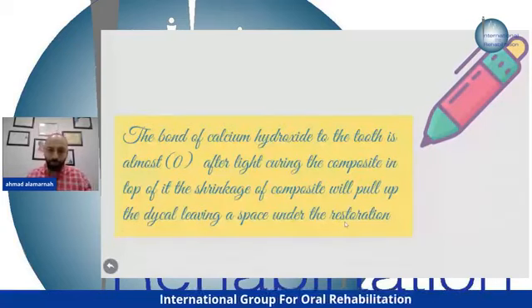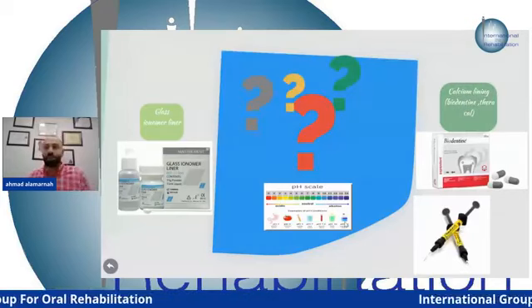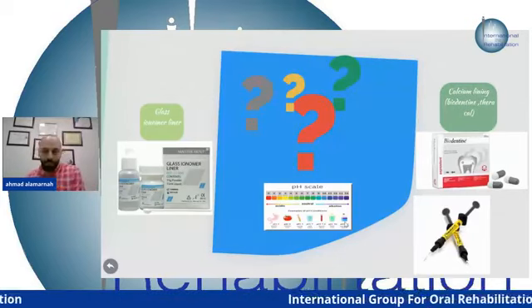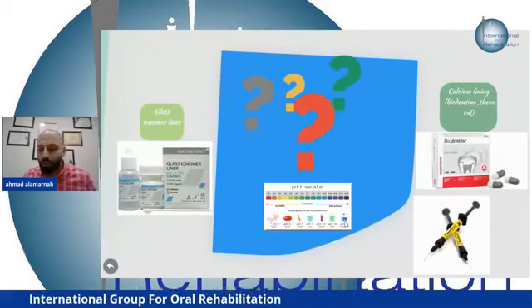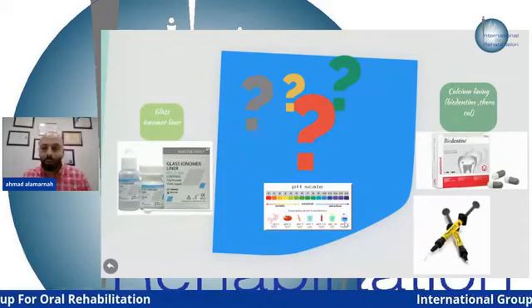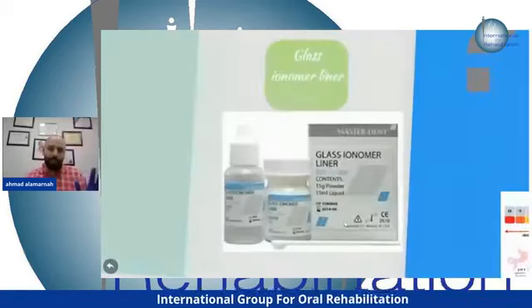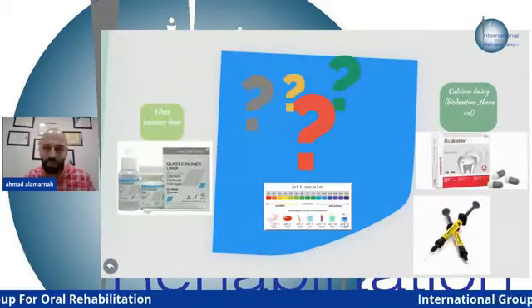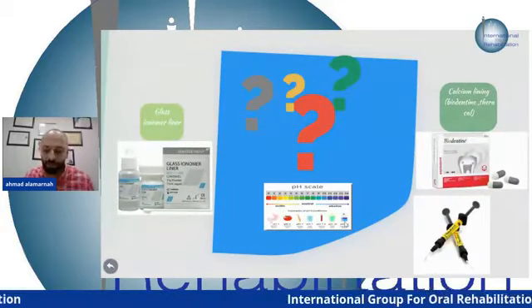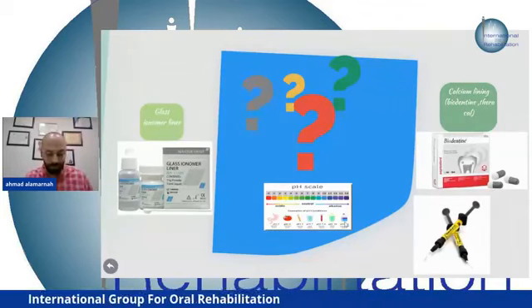So what should we use? We have two options: the calcium lining material and the glass ionomer lining material. I do use the calcium lining material all the time. Why? There's a glass ionomer and there's the calcium. Why do we use the calcium containing material, not the glass ionomer? Please let me hear your answers.